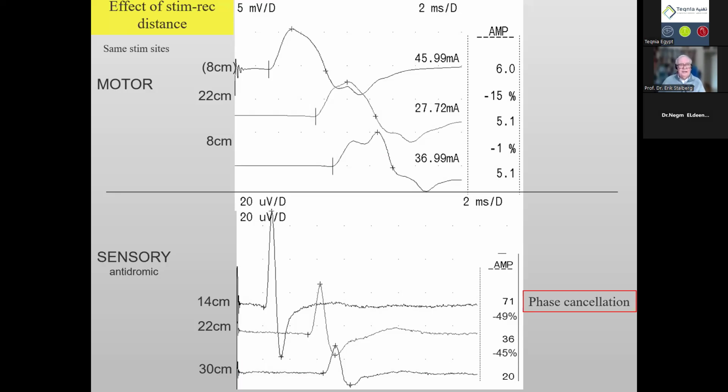Our routine is to have a standardized distance for all our recordings between stimulus and recording, which is the best. Sometimes it's difficult, small hands, large hands, but as long as we can do it, it's advisable.